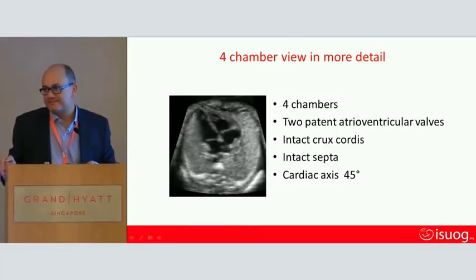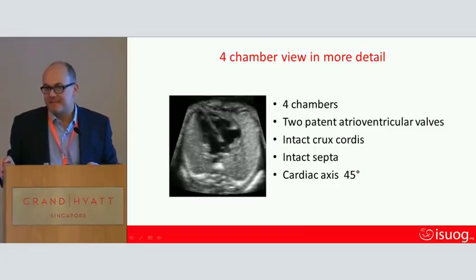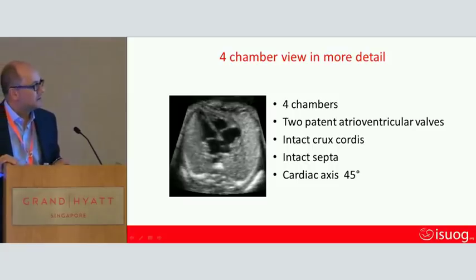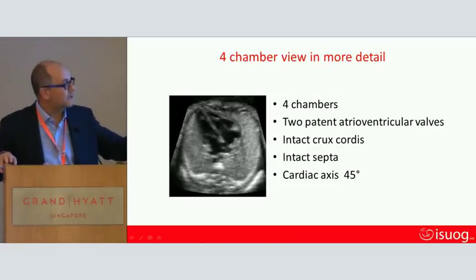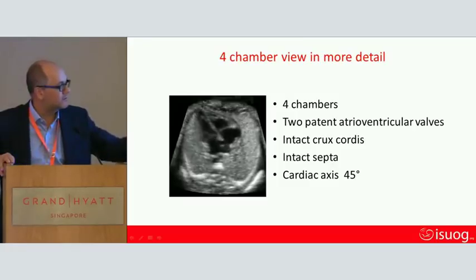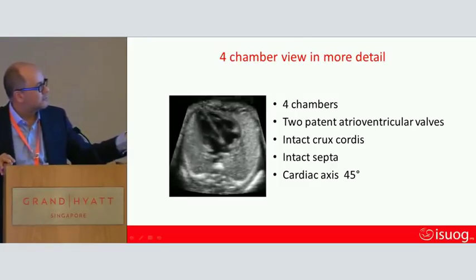Are you happy with it? Yeah? Yes, it's normal. Good. This is a normal four-chamber view. It's on the correct side. I'm telling you that because I've just scanned this baby a minute ago, and the stomach was there on the left. You can see 4 chambers.